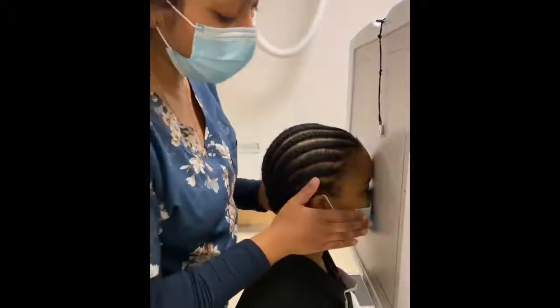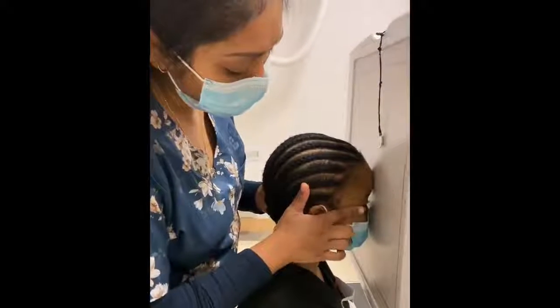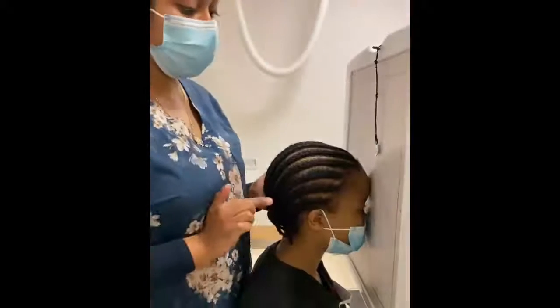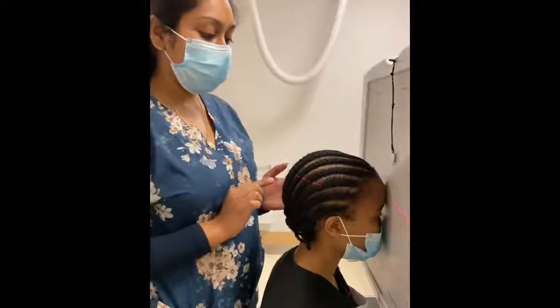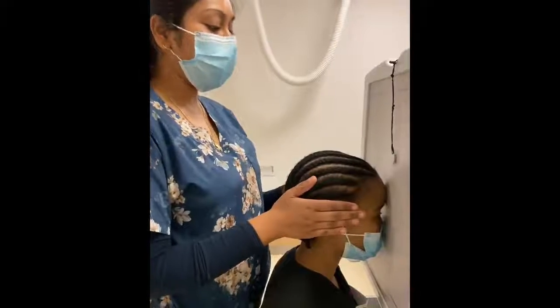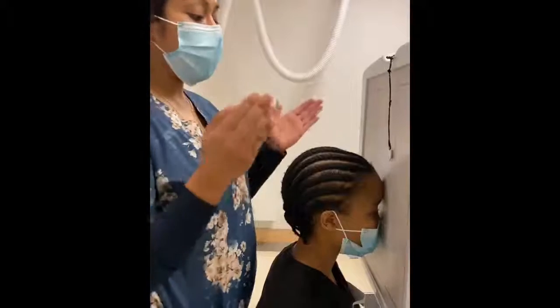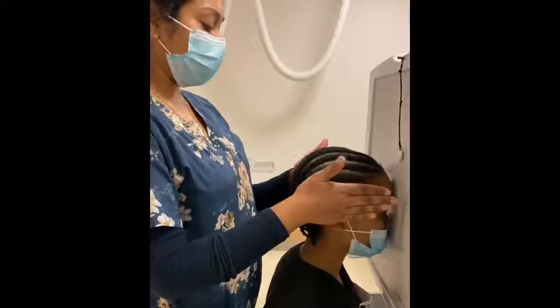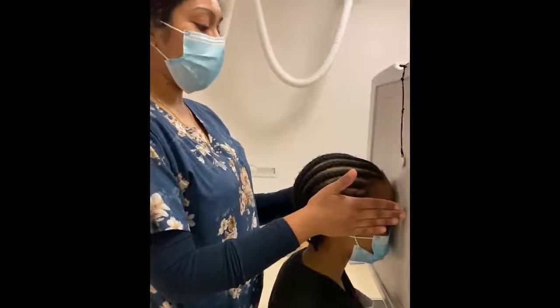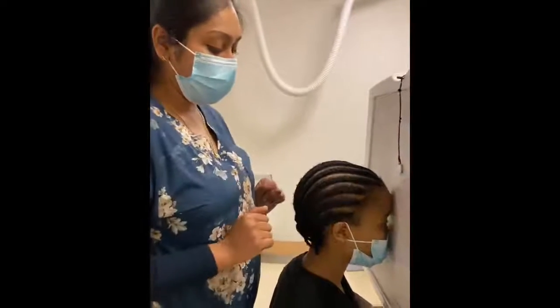So we tuck the patient's chin slightly in from there so that the OML is perpendicular to your image receptor. We also need to make sure that our mid-sagittal plane is nicely perpendicular, and then you should not have any tilting or rotation. So again, you can place your hands at the sides of your patient's head and just make sure that it's nice and straight. Okay, so my patient looks nice and straight.